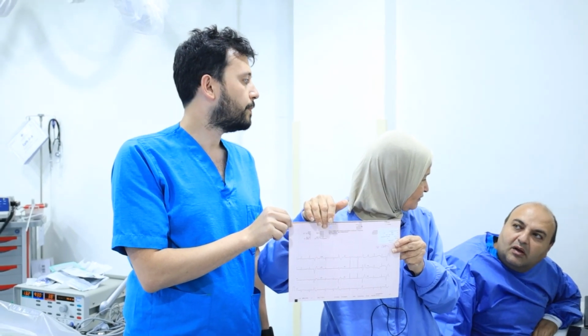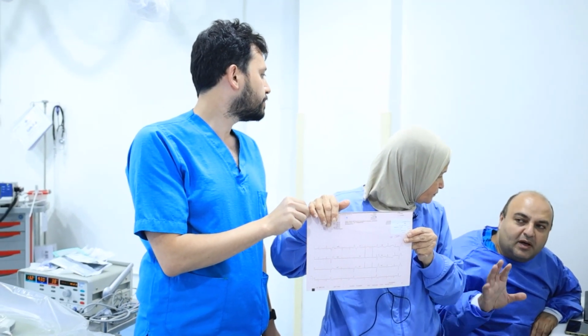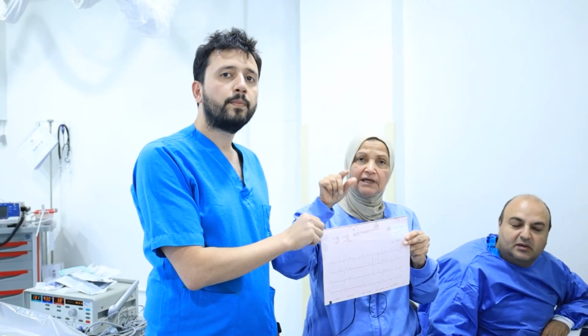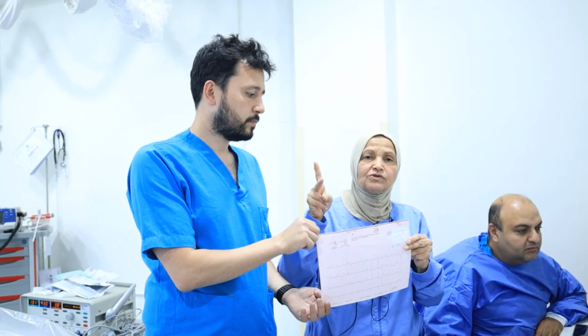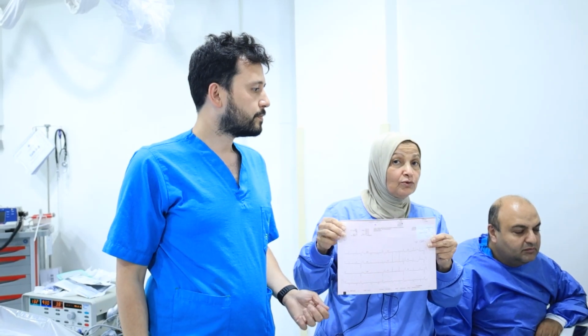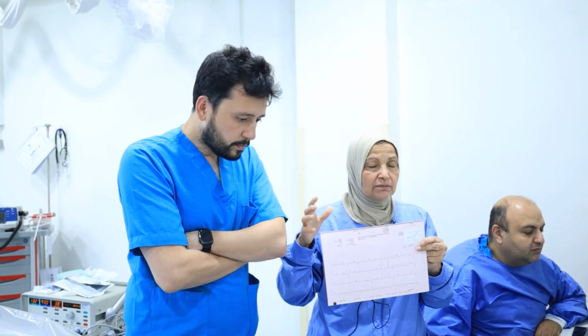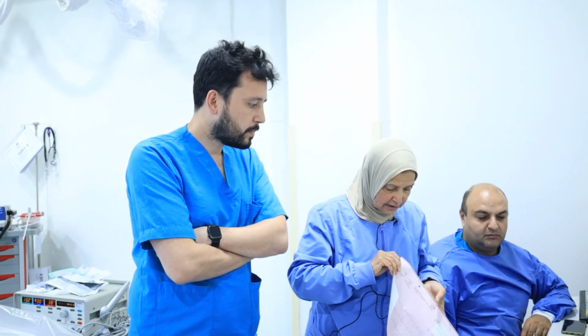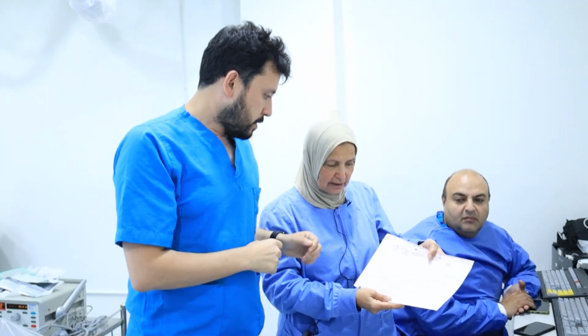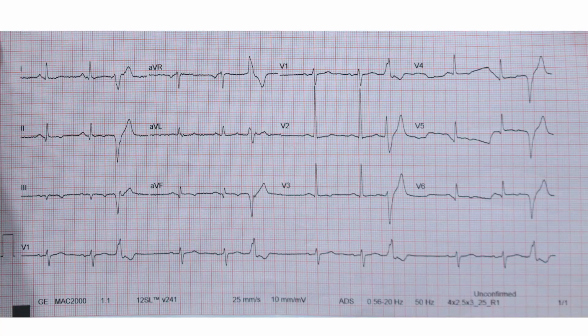post-septal region of the left ventricle, in the papillary muscle. Post-medial papillary muscle. It was ablated the first two sessions by CARTO, but today we could not get a CARTO catheter, so we did it conventional. Salah and Dr. John did this nice case. Salah explained the localization of the PVC.